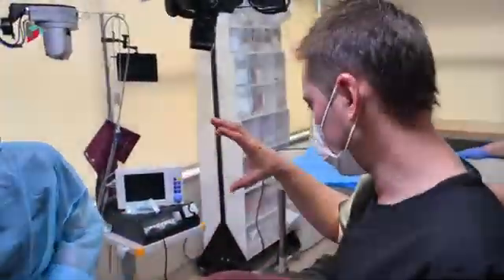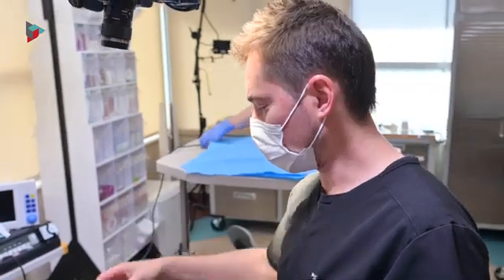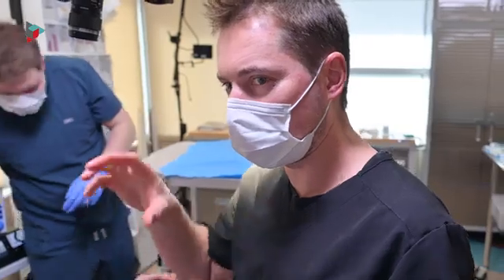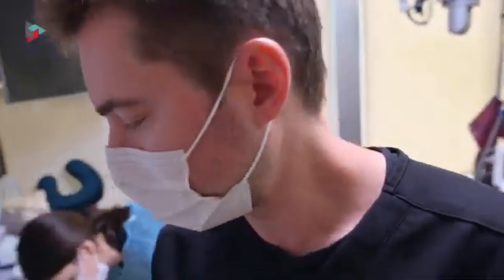It was deeper, like in the bone, and it was almost like under the teeth, like this. So the entire prevent was going back and forth. Very good.